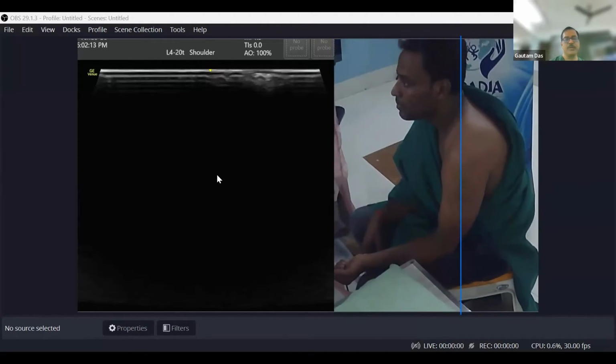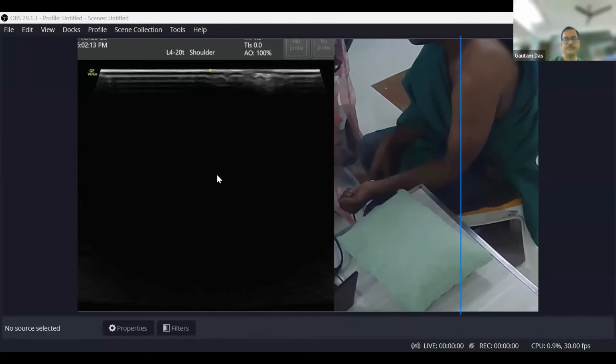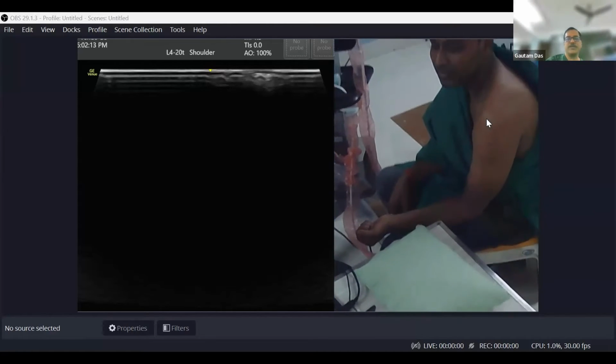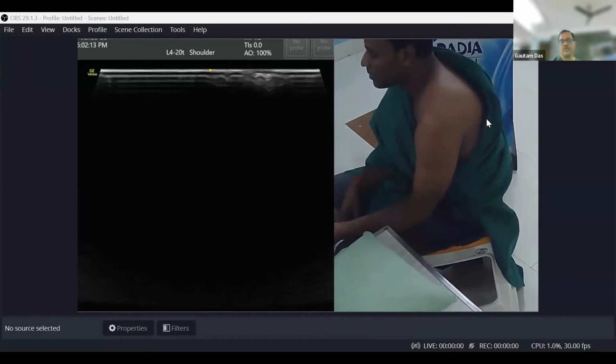ultrasound probe series. Can you see it? My slides? I can see Sanjeev Da and picture, sir. Yes, sir, I can see it. Right.